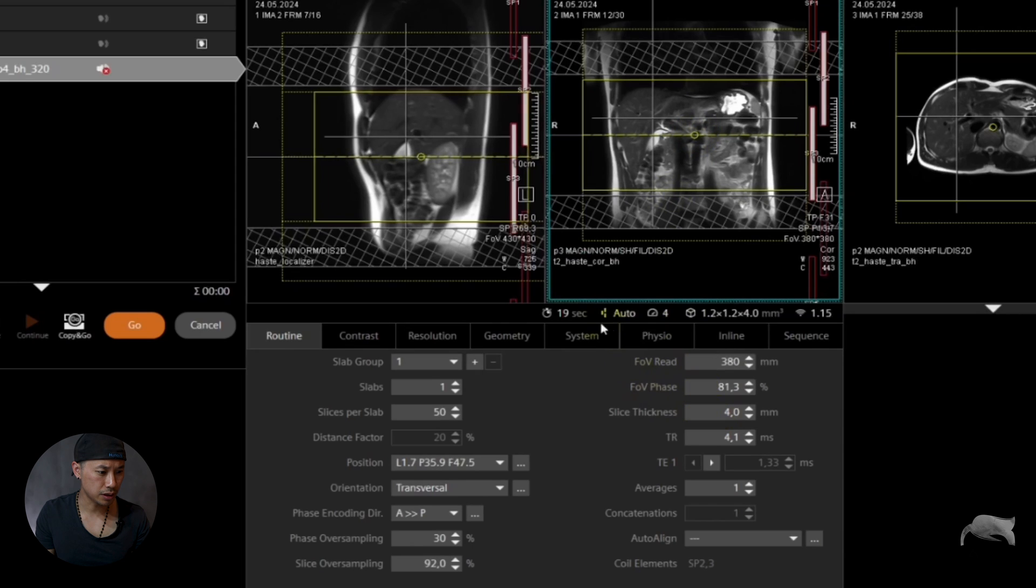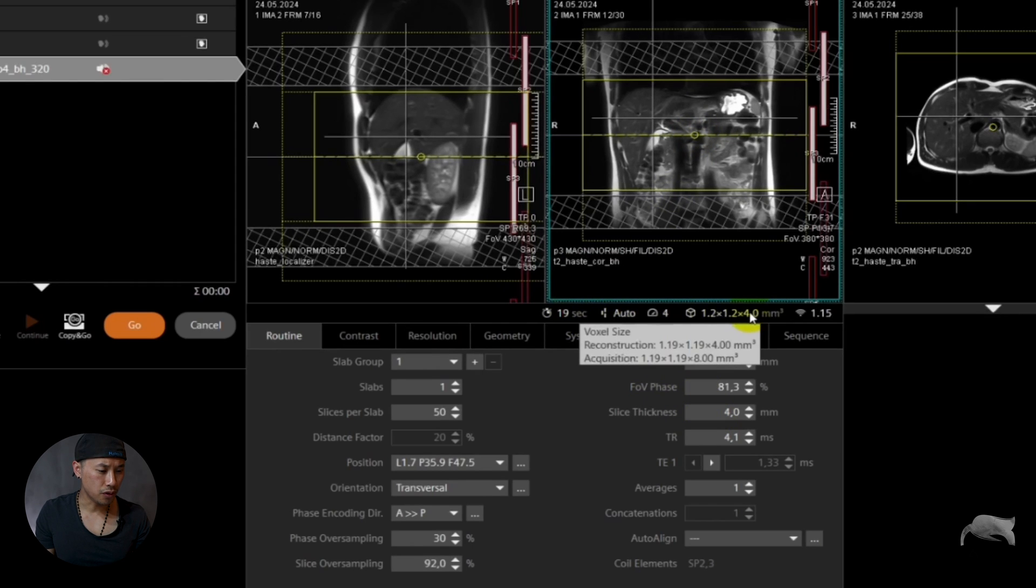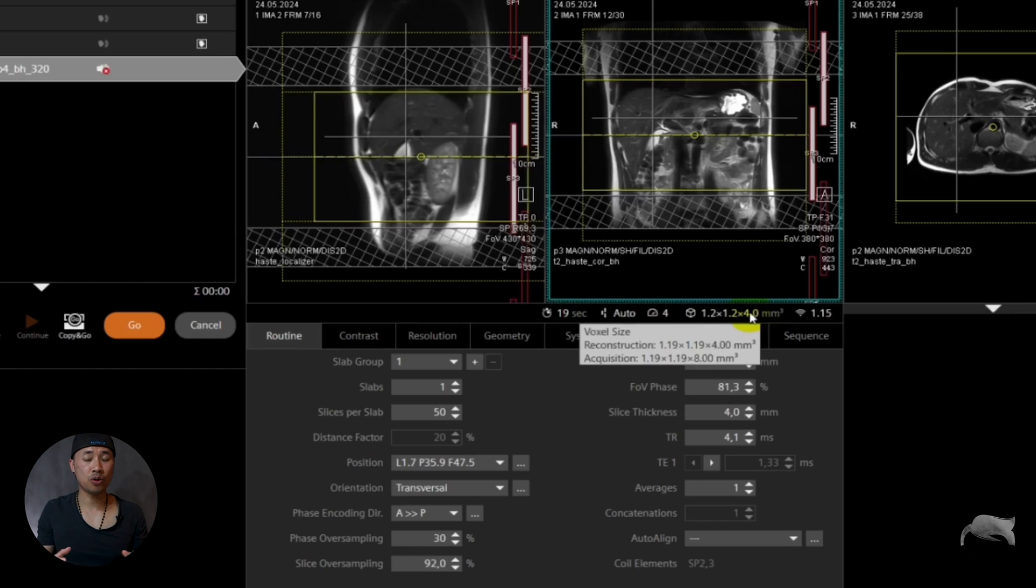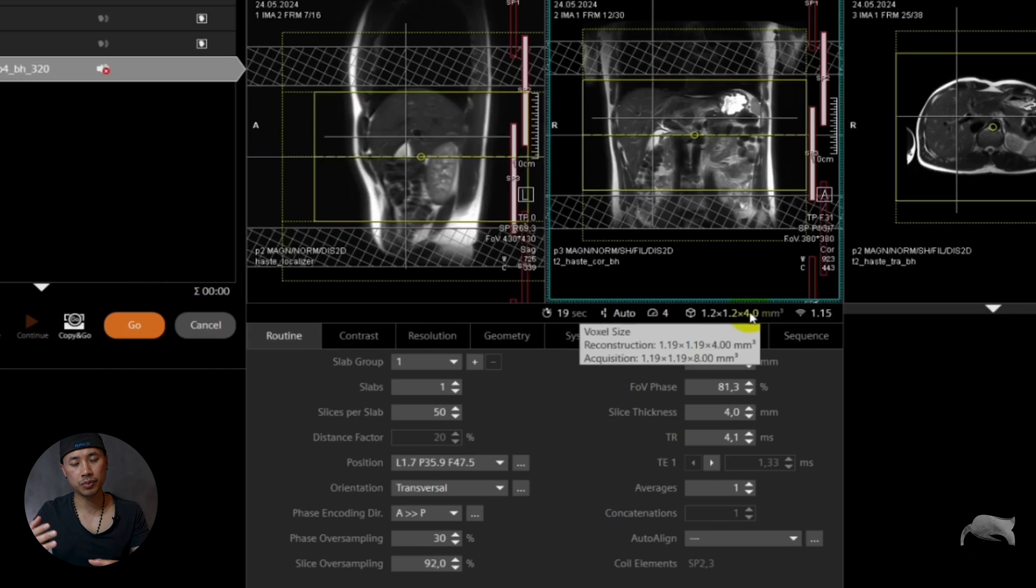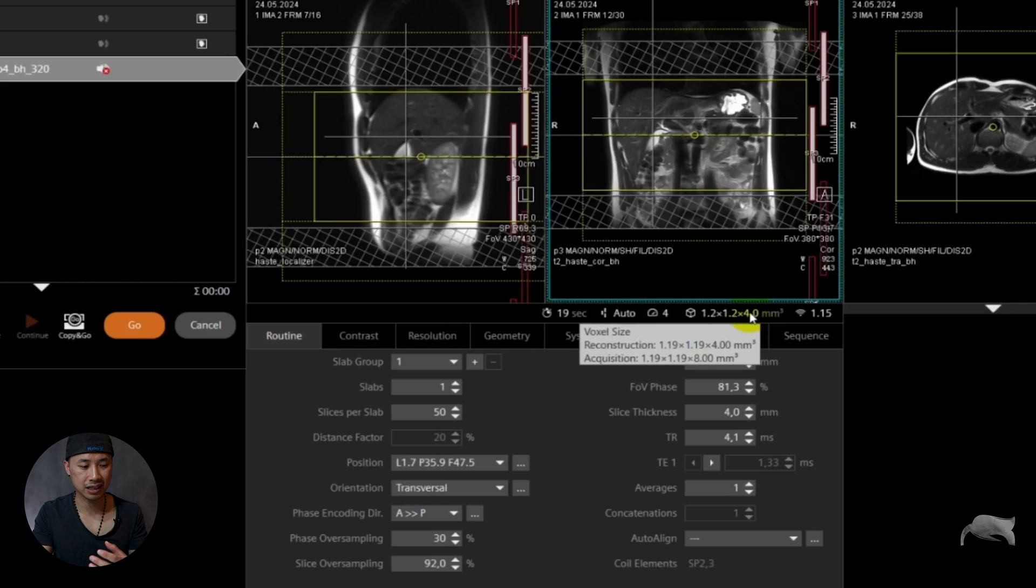So if you hover over here it's now 8 millimeter. You are acquiring 8 millimeter and then interpolated to 4. The reason for that is that you have 50% slice resolution. So this is no good at all. Of course the patient might or can hold the breath for 19 seconds but the quality is not that good.